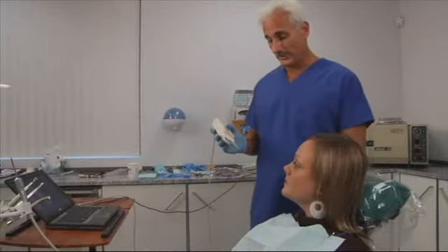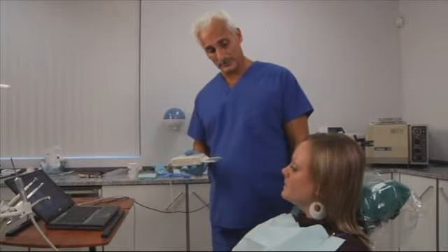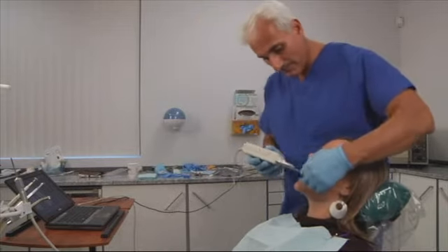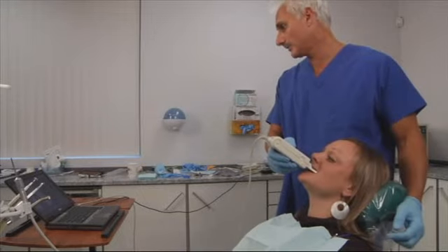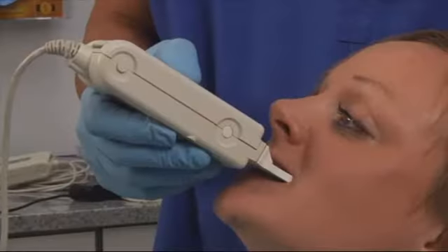So we made those subtle corrections, so I want to remeasure and make sure we improve the situation slightly. So I'm going to have you bite down and slide to the right again. Okay, so bite down once for me. Good, open. Bite down again, firmly. Now go to the right.